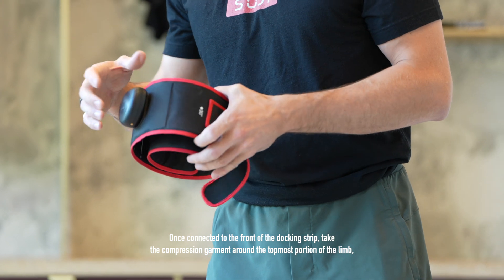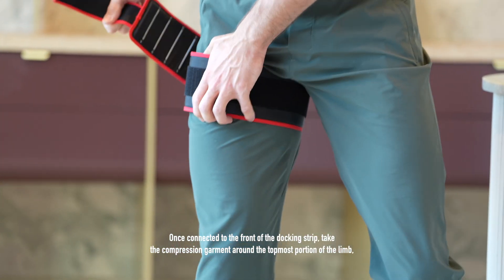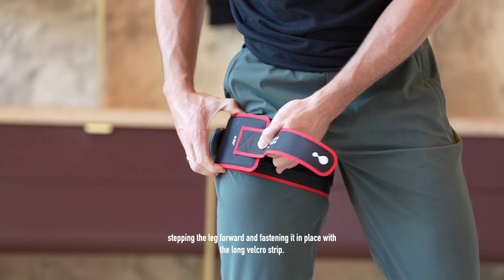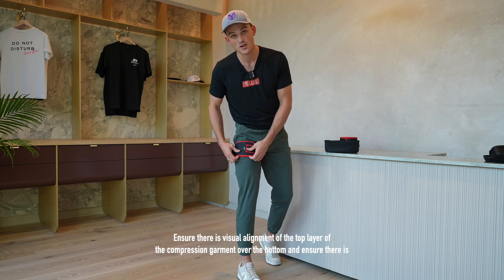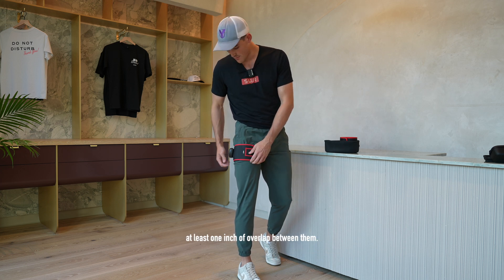Once connected to the front of the docking strip, take the compression garment around the topmost portion of the limb, stepping the leg forward and fastening it in place with the long Velcro strip. Ensure there is visual alignment of the top layer of the compression garment over the bottom and ensure there is at least one inch of overlap between them.